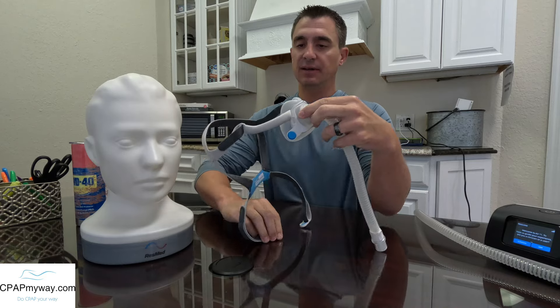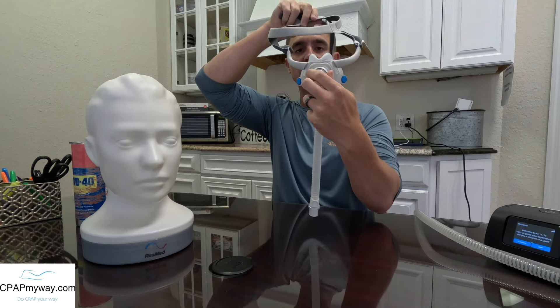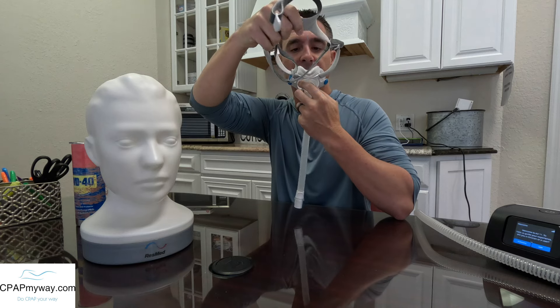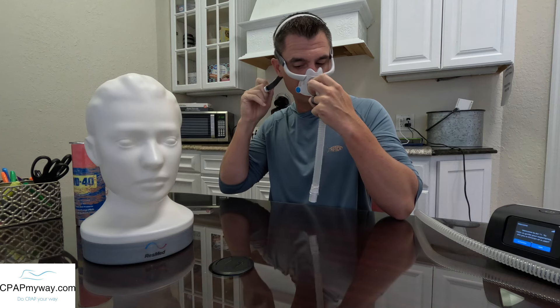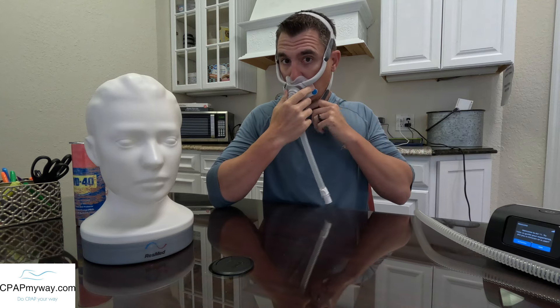As far as the cushion itself and the way it attaches, it is a pretty large departure from the F30. As I mentioned earlier, it fits very similar to the F30 — you just have to put it under your nose, over the back of your head. Then one at a time, you pull those magnets underneath and attach them the exact same way, then tighten top and then bottom.